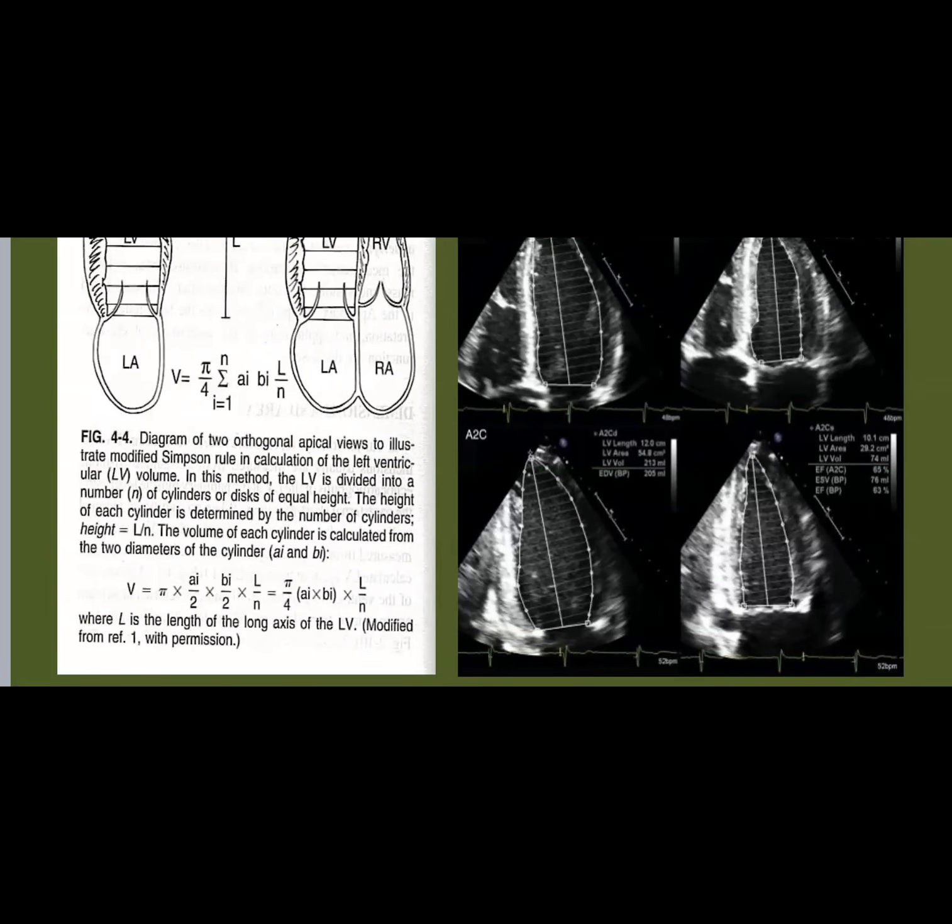We need the apical 4 and the apical 2. So we measure the systolic frame in the apical window from the apical 4 chamber, and the diastolic frame. And we go to the 2-chamber view and apply the same systolic frame and diastolic frame, and we get the ejection fraction expressed in volume, because the equation will translate what we do by tracing into volume.